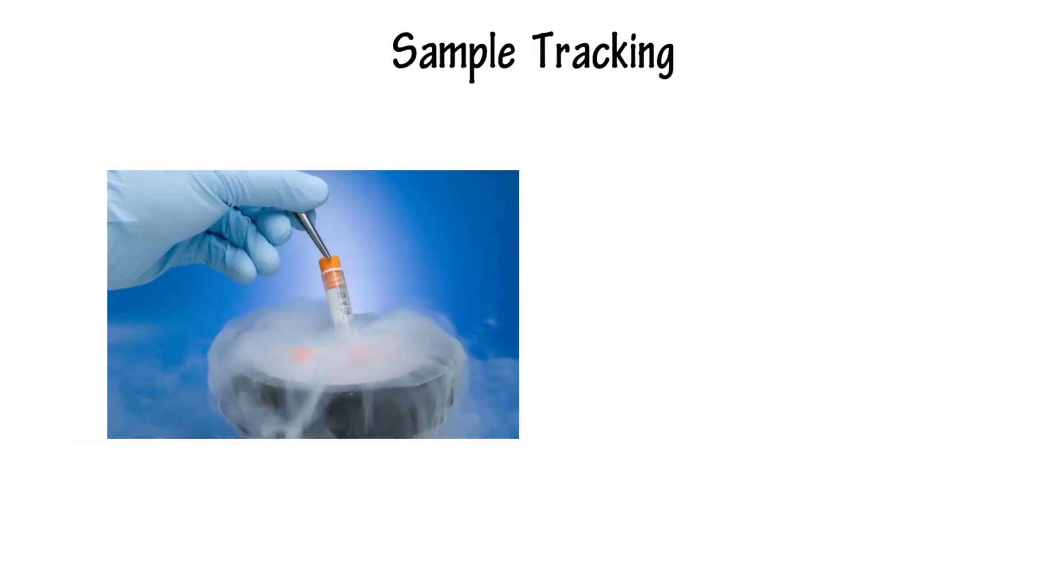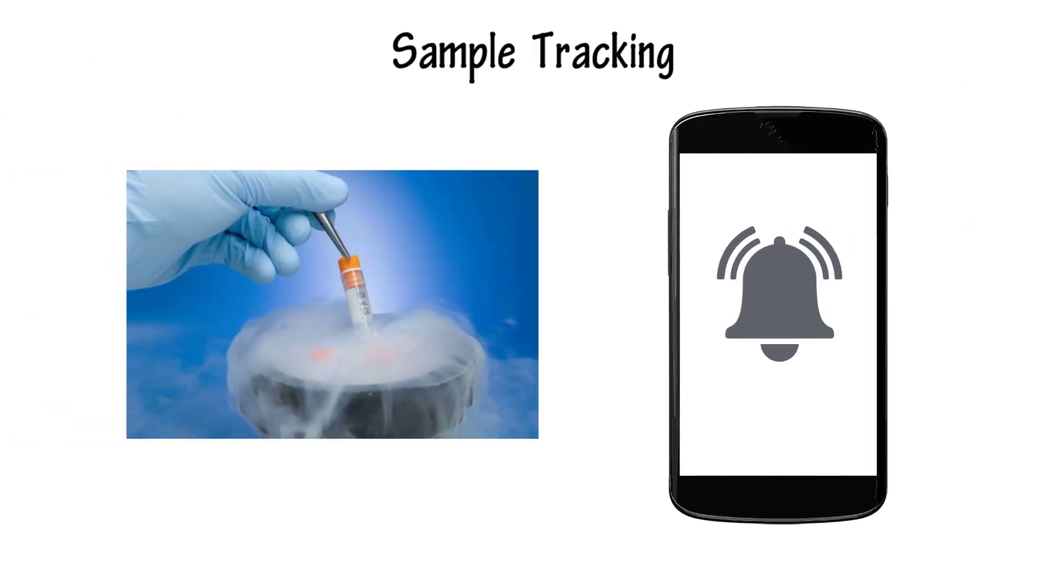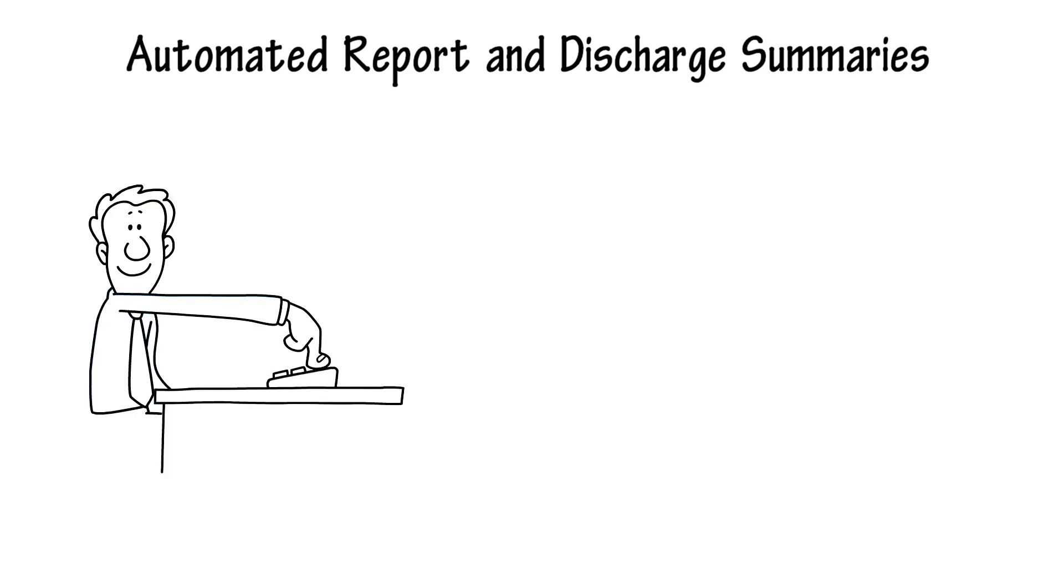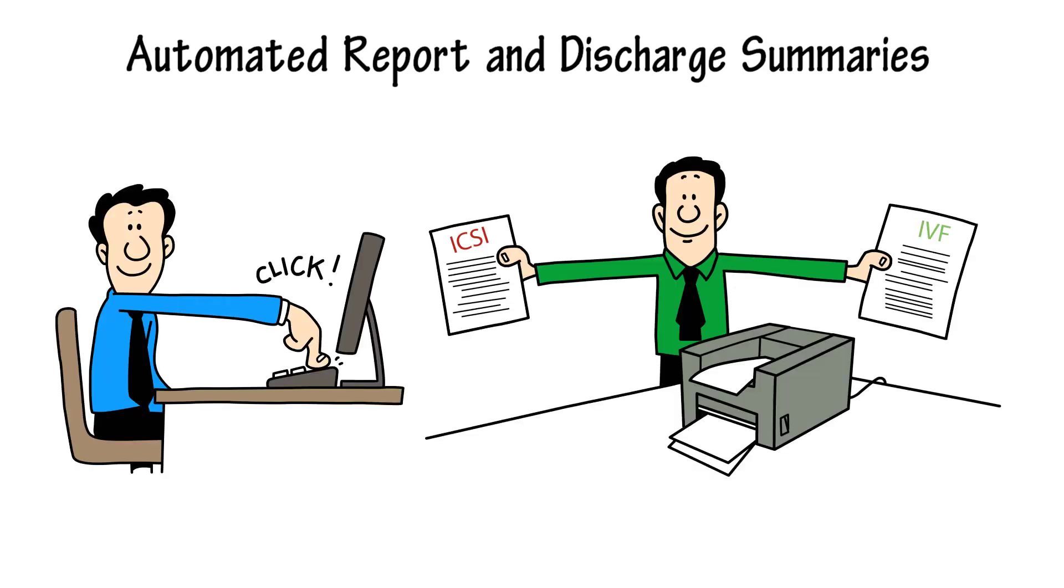Sample tracking tracks the cryopreserved sample location and notifies about free space availability. Automated reports and discharge summaries are generated instantly in the format that the hospital wants, with a click of a button.